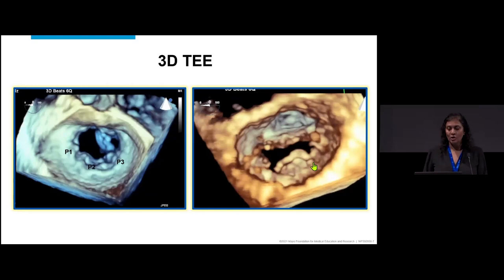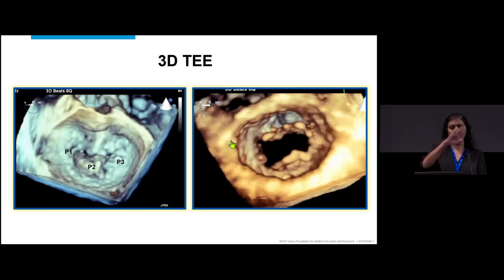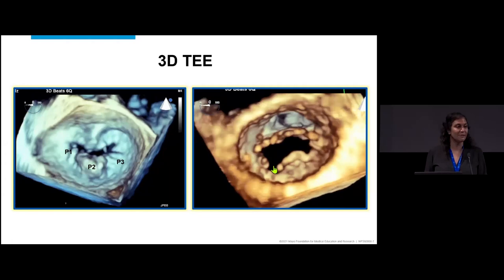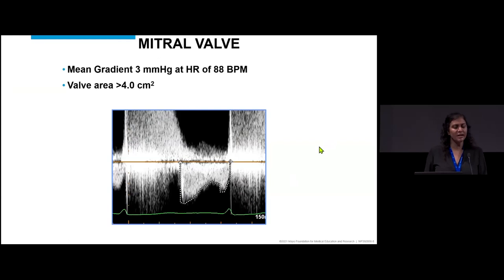This is the ventricular aspect. There's a cleft-like indentation between the scallops. When you flip it over the way this machine does, P3 is over here, and you can see the cleft-like indentation between P2 and P3 — a very important thing to recognize for both surgical mitral valve repair as well as percutaneous approaches.